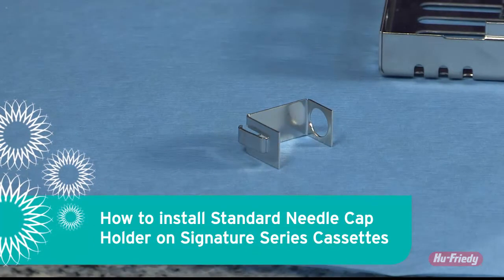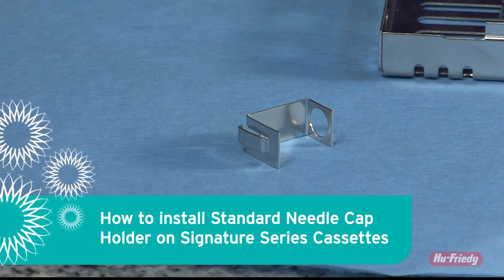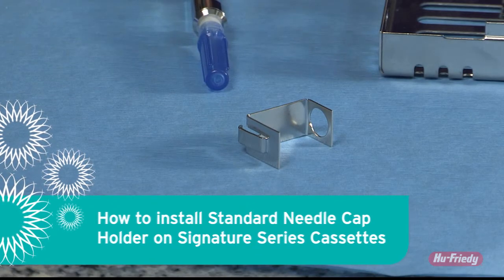A needle cap holder is ideal for safer protocols when performing single-handed recapping of your surgical syringes.